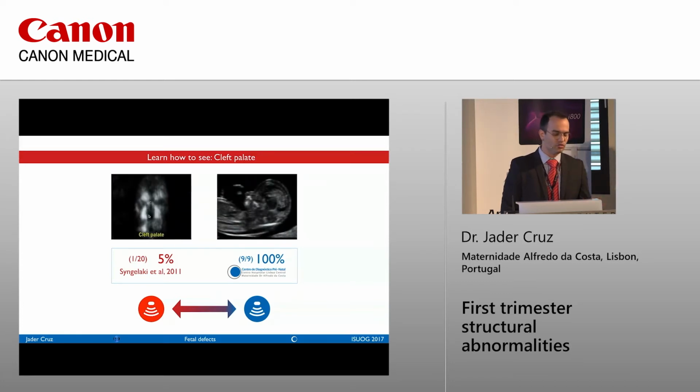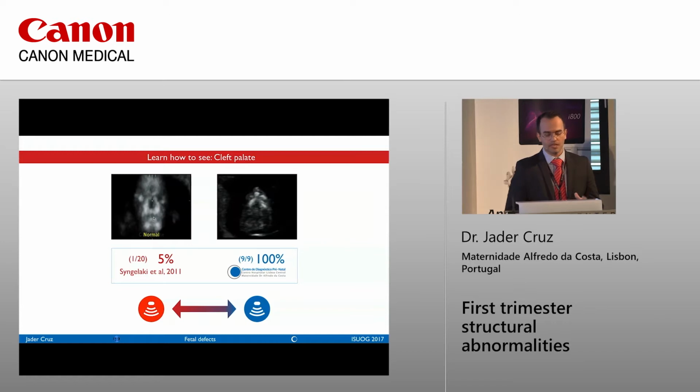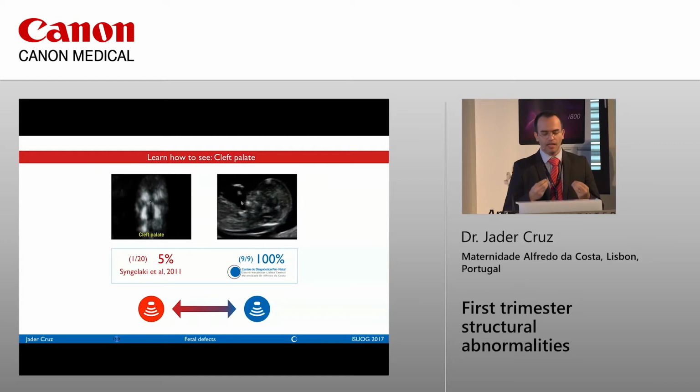And if it is closed, you probably don't have a cleft palate, and if it's open, you're probably having a cleft palate. So in the original study, it was not part of the assessment. In the unit I work, this is part of the assessment in every single patient. In all patients, we look at the face, we see eyes, we see palate, and because we look at that in every single one, we detect all of them.